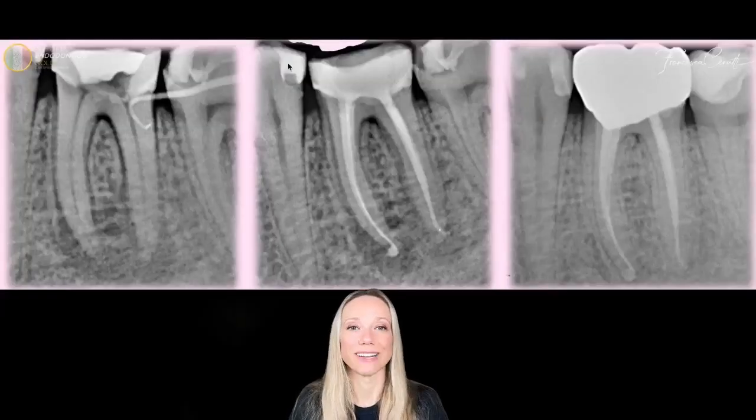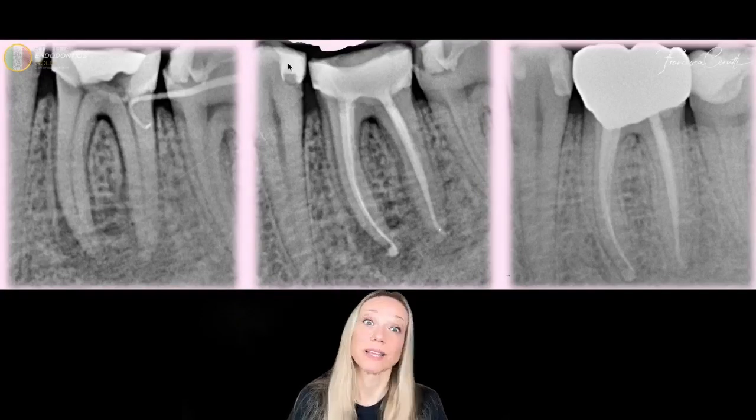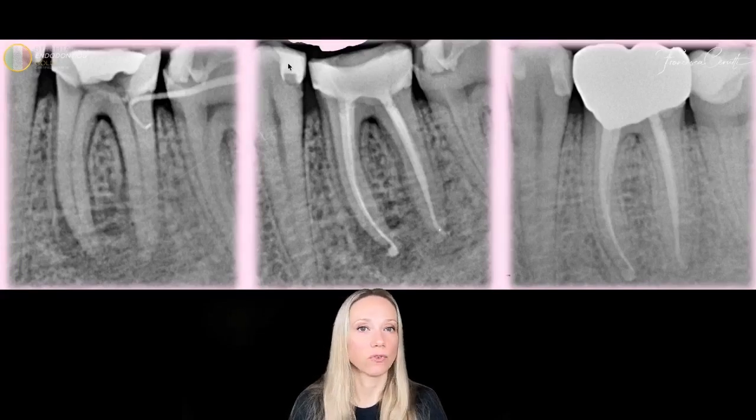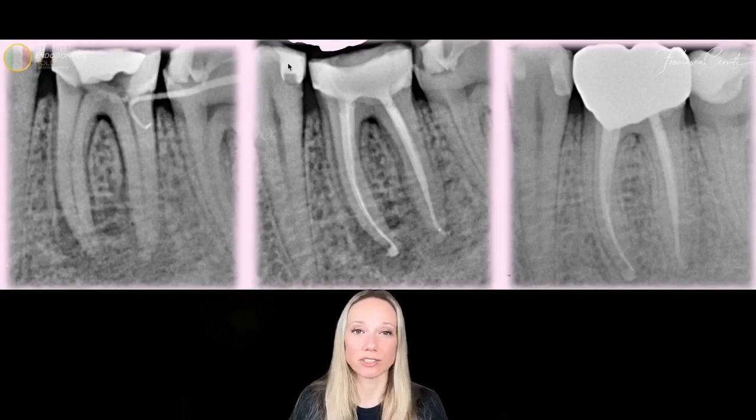So when we have an initial treatment, it's not so difficult to obtain a good shaping. Well, sometimes it is in complex anatomies, where we have to negotiate with hand files, etc. But in most of the cases, we just have to follow the path of the pulp, and so we just have to try not to make procedural errors and to follow the original anatomy of the tooth.